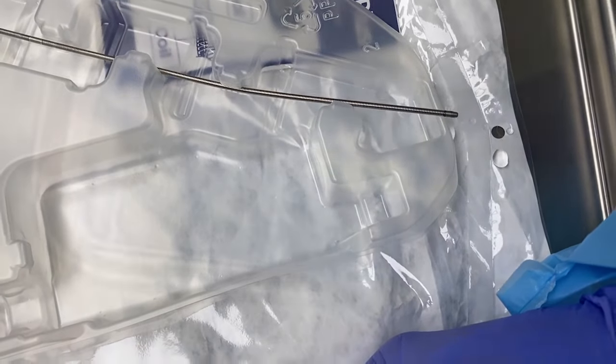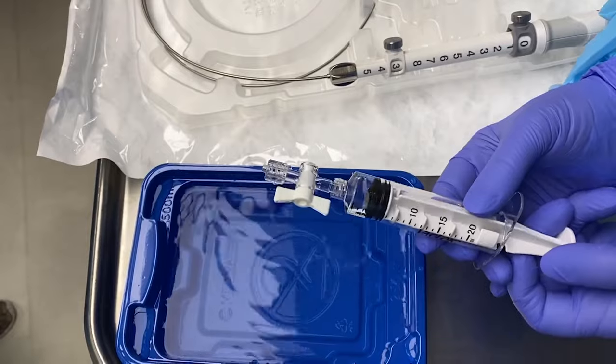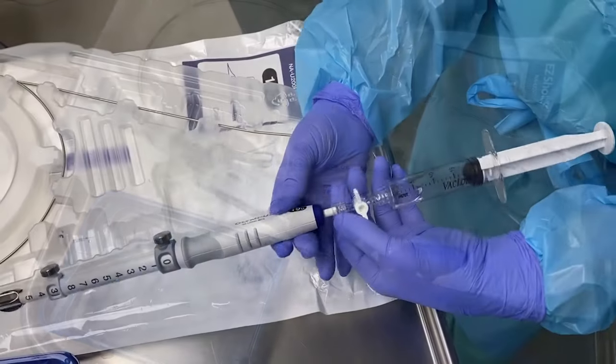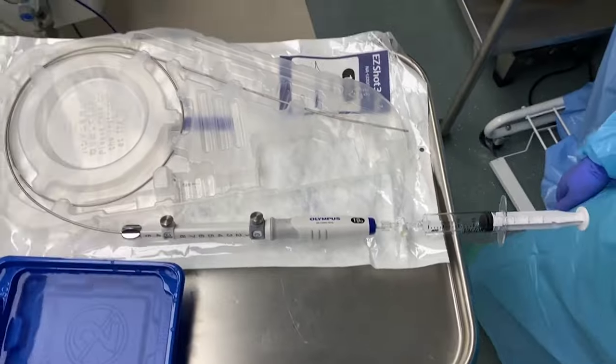The suction syringe is then filled with two cc's of water and full 20 cc's of suction is applied. This suction syringe is attached to the back end of the needle, which completes the prep for the needle.